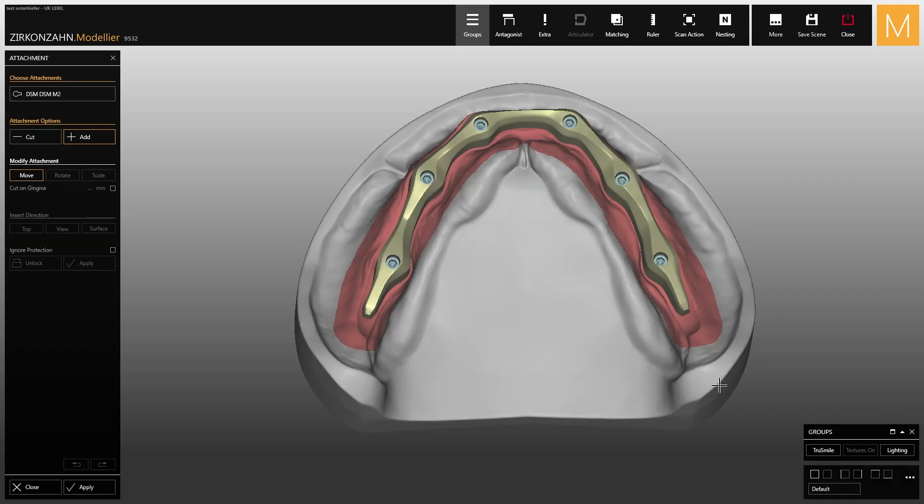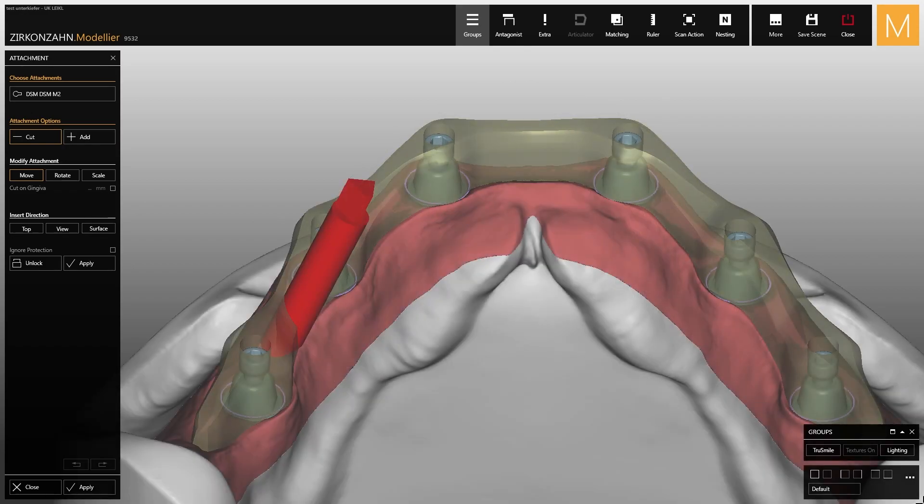Place the attachment on the bar and activate the cutting mode. During the attachment positioning, pay attention to the two guidelines which indicate the correct attachment height.